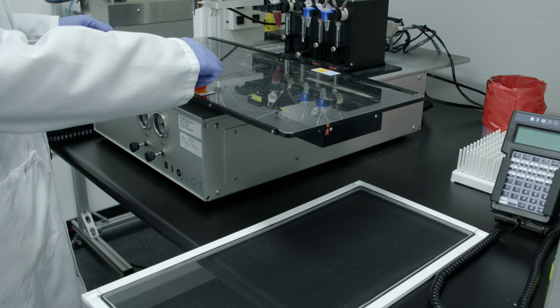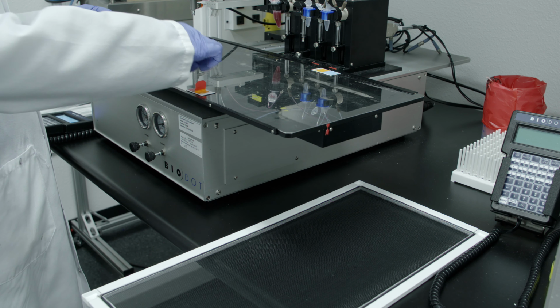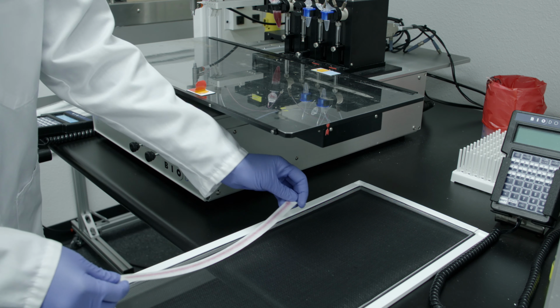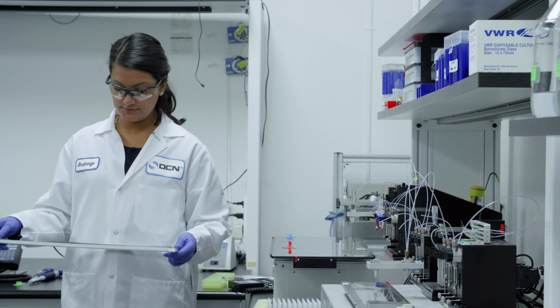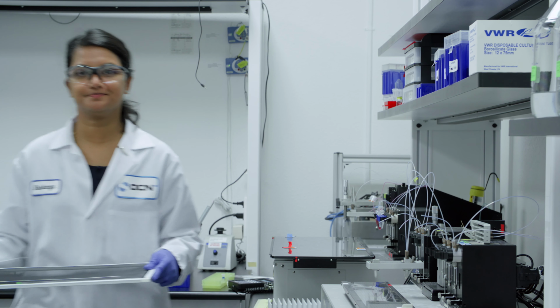So now that we've dispensed our detector label, we are ready to put this on a screen and dry for 1 hour. And we're now ready to assemble our test.